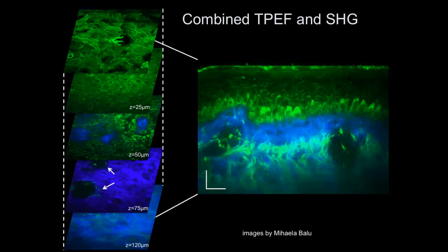You see here, this structure, those are cells that are very bright. Those are cells that are just born here on the basal layer. And they actually morph into keratinocytes. And they lose the fluorescence because they dry out and they form the hornified layer here that forms the stratum corneum. Okay, so you see the individual cells beautifully through NADH fluorescence in a live person.